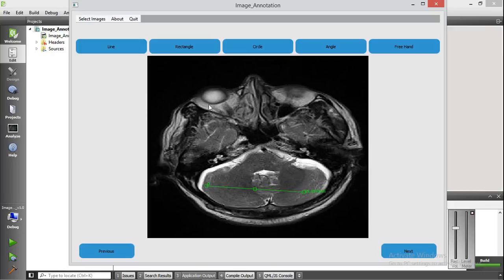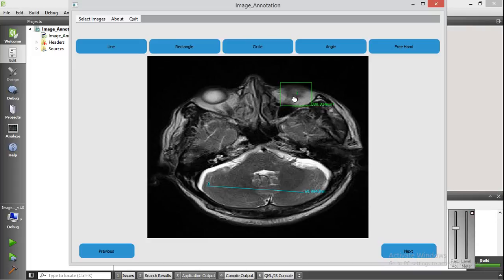To annotate with a rectangle, you select the rectangle option and draw a rectangle on the image. As you can see here, the area under the rectangle annotation is calculated. You can resize and move this rectangle annotation.